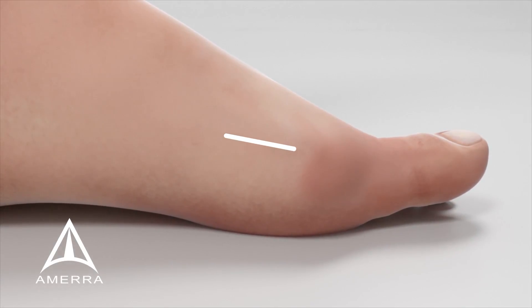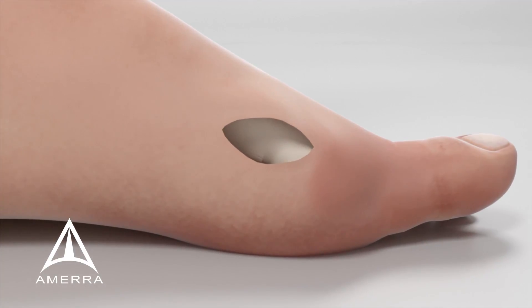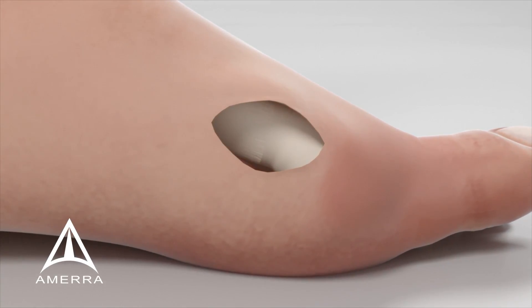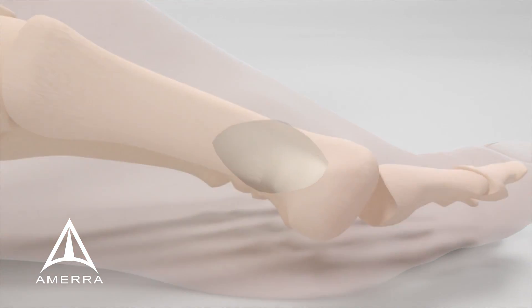Make a two centimeter longitudinal medial incision over the intended osteotomy site. The incision size may vary depending upon surgeon preference and patient anatomy. A two centimeter incision is recommended to provide adequate access for hardware while limiting the final incision size.